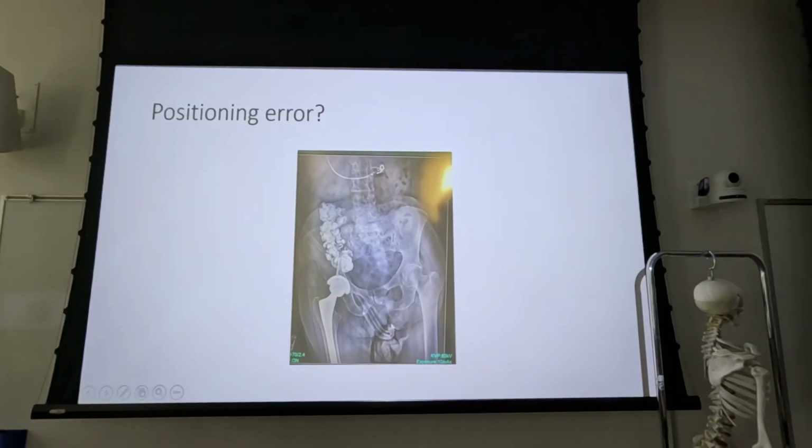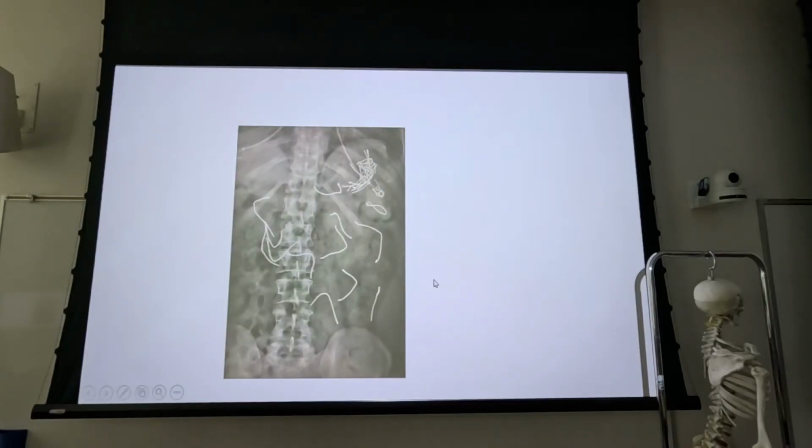Was it a pelvis? If it was a pelvis, then they failed to get the inferior border of that prosthesis, so it's a repeat. Was it abdomen? I don't know. If it was positioned like a pelvis, it was a poorly collimated pelvis at that. So again, nothing really good with that one. I wish I remembered what the history was on that one.